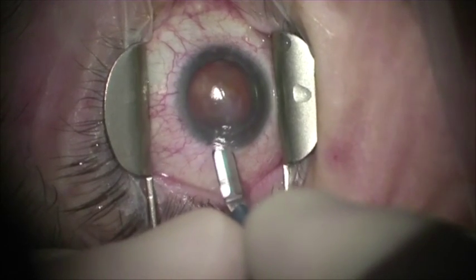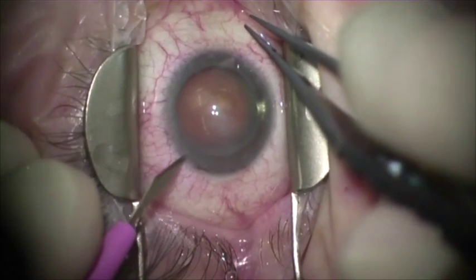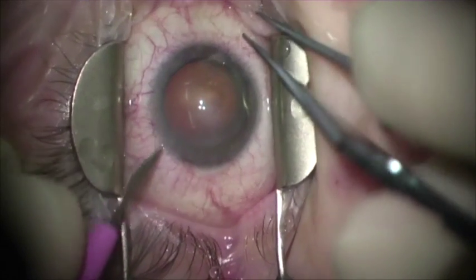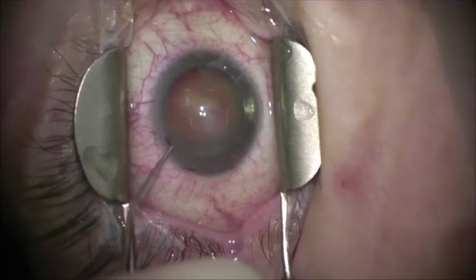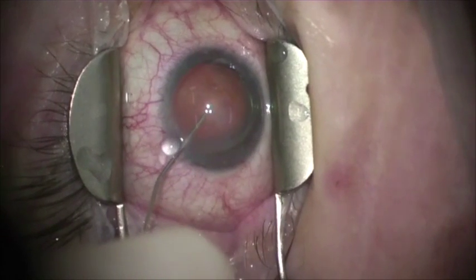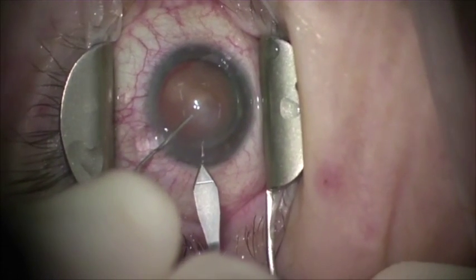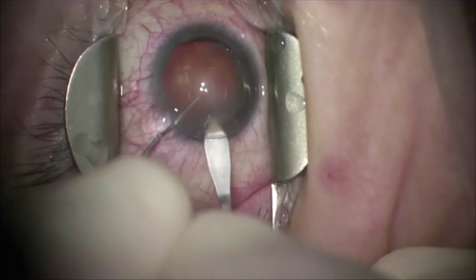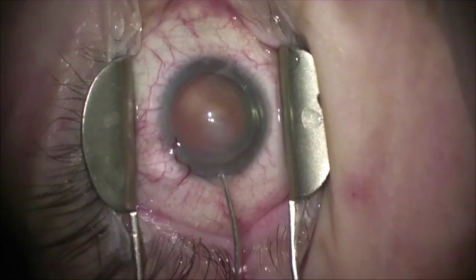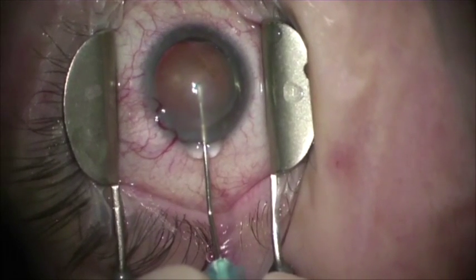I like to do a temporal incision that's multi-planed. I use viscoelastic of hyaluronate in these cases. Use my standard 2.4 millimeter keratome. At this point, it was found that the view-in was not adequate to perform a competent capsulorhexis.